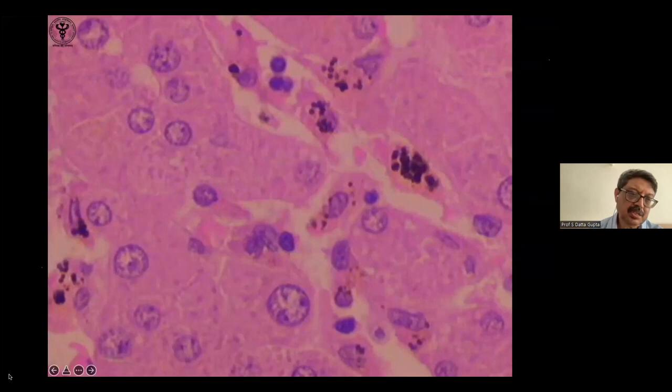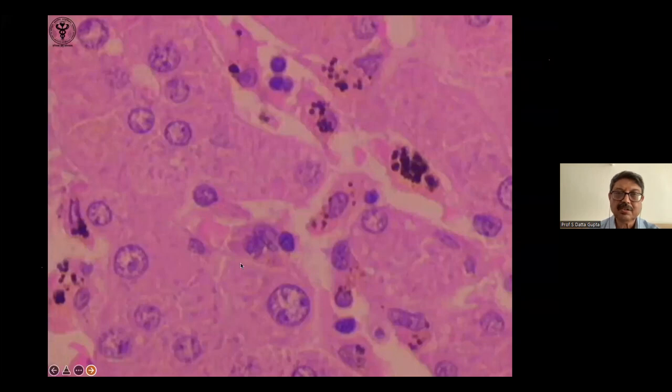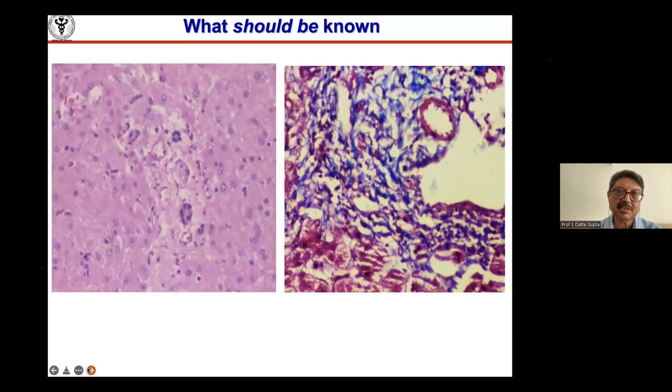These cells separated out. These are the sinusoidal cells. These are the hepatocytes, and this is the space of Disse. Normally, you don't see it. This is because of autolysis. You can find the sinusoidal cells better when there is malaria, because they swell up with pigments, or when there is hemosiderin, right?